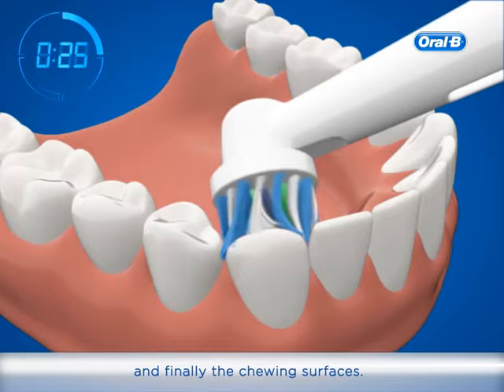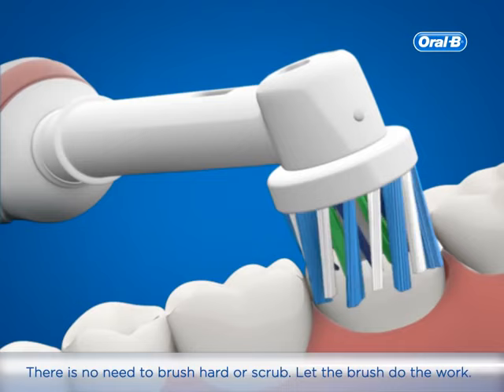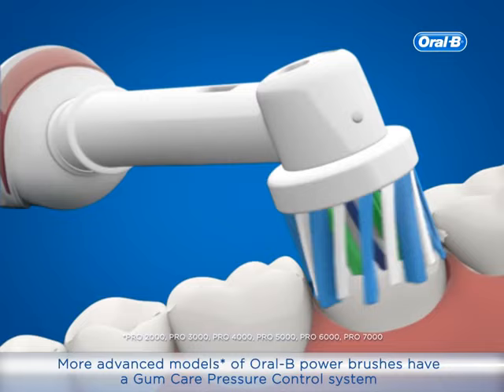Finally, the chewing surfaces. There is no need to brush hard or scrub — let the brush do the work. More advanced models of Oral-B power brushes have a gum care pressure control system that alerts you when brushing too hard.